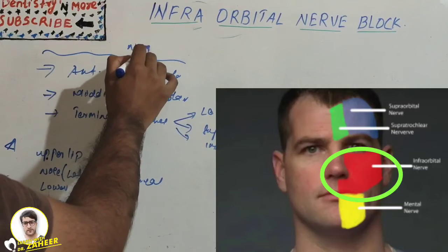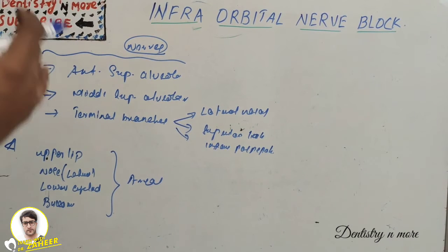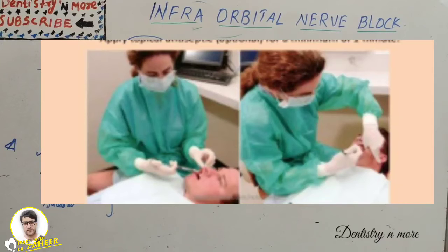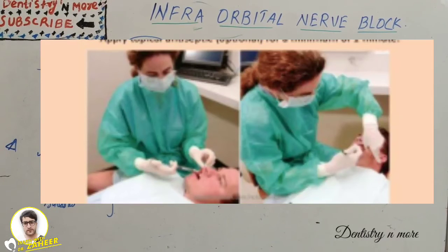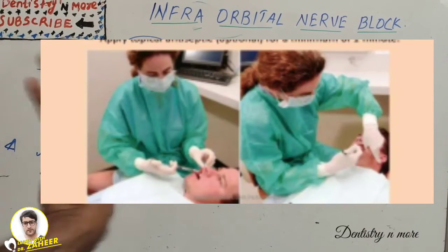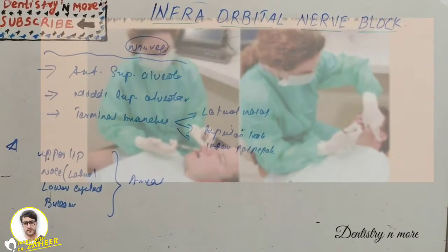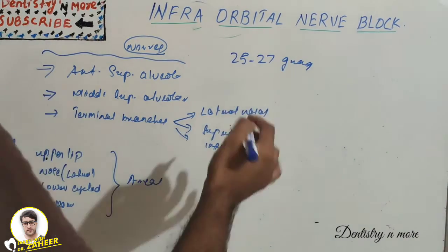Regarding patient and dentist position: the patient's head, neck, and trunk should be on the same straight line with the back of the chair tilted so the patient is in a supine position. The occlusal plane of the maxillary teeth should be at a 45-degree angle to the floor. The dentist stands on the right side in front of the patient for a right-side injection and alongside the patient for a left-side injection. The needle commonly used is 25 to 27 gauge and it will be a long needle.